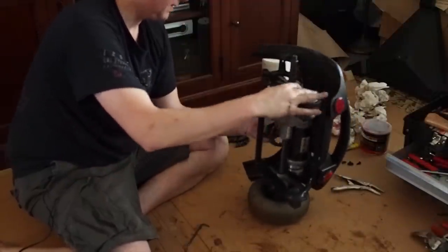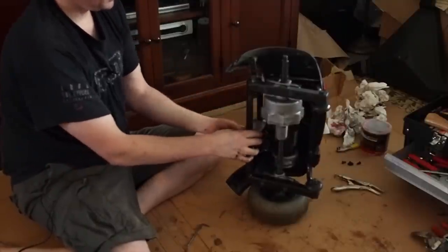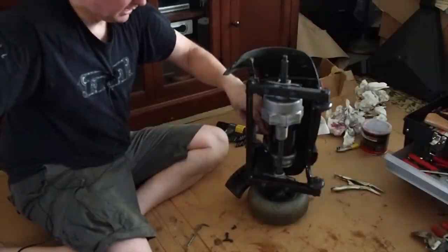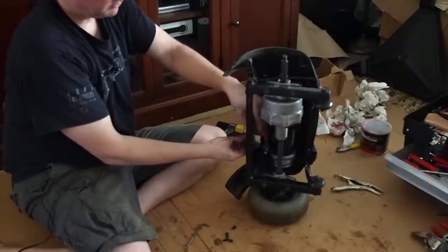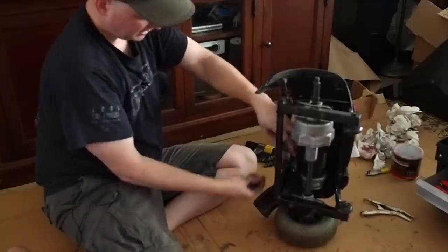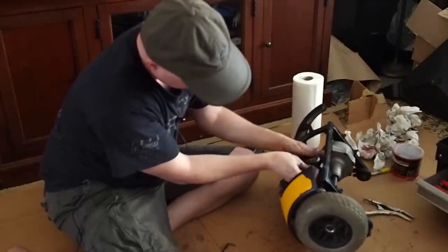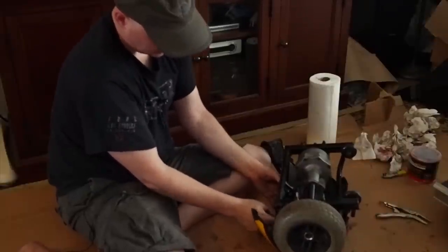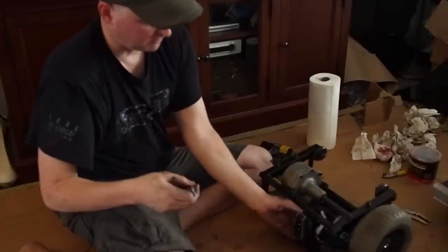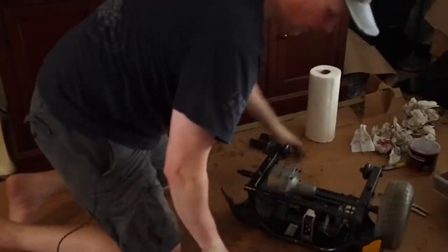Before I put the wheel back on, it'll be easier to deal with. I have easier access without the wheel on, so I'll put this on here. This is a little bit of a trick. I'll put it on lightly. Here are the screws. Put it on lightly at first, and then I'll connect it to the forward part of the scooter, and slide it around to make it fit. And while it's connected, I'll crank it down. But I can't crank it down now because this is not necessarily going to be in the right spot. So I'll put this connector so it's snug, but I still want to be able to move it around. There's a bunch of room for it to go, so I'm going to leave it like that because it will need to be moved.